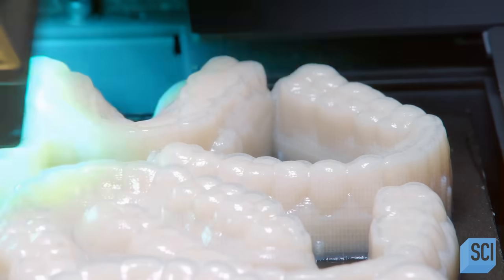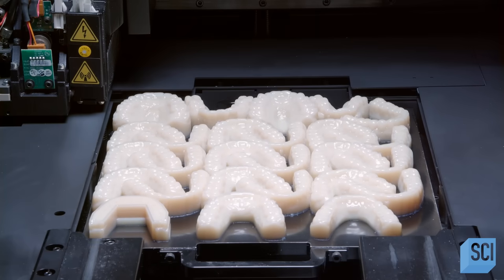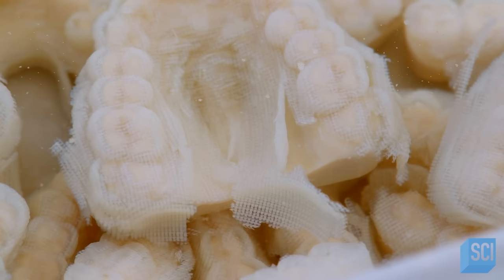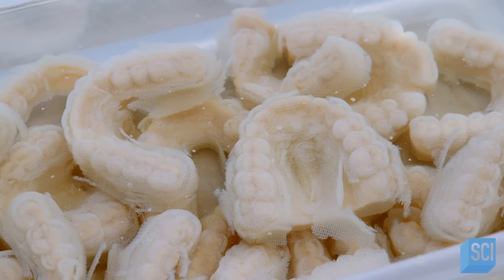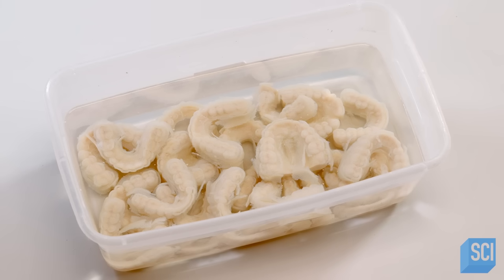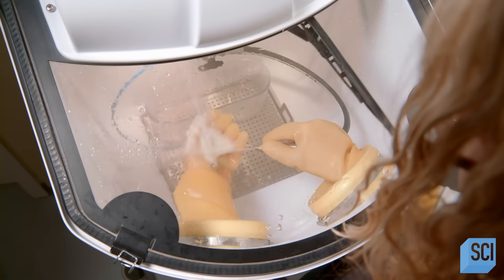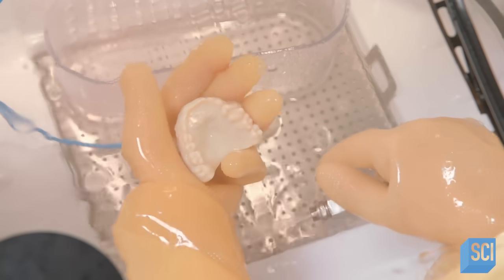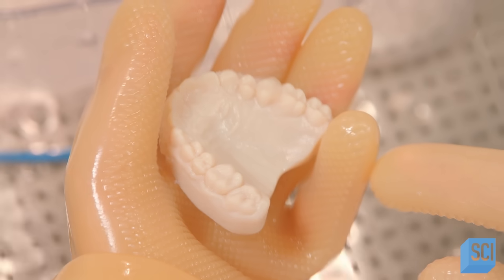The printer prints resin and a support material. The support material prevents the model from shifting during the printing process and provides structural support for the resin in complex areas. The support material is water-soluble. Once a model is printed, they soak it in water for 10 minutes, then remove the material with a pressure washer.